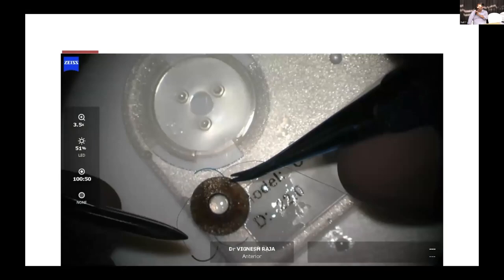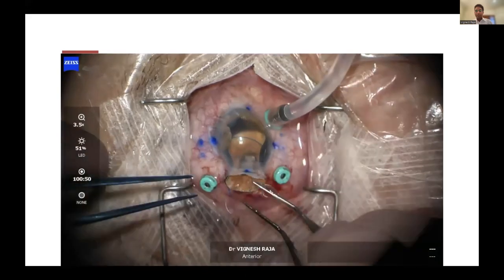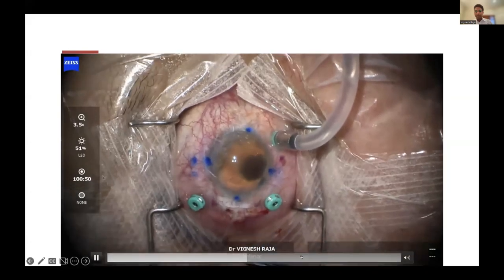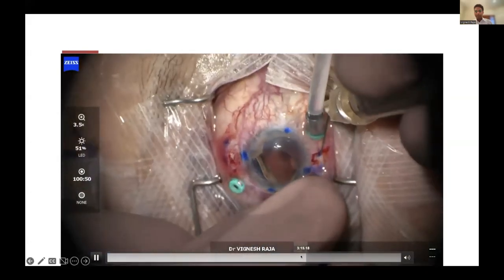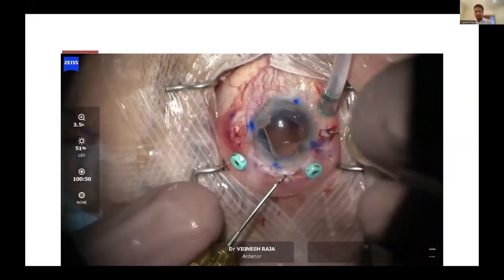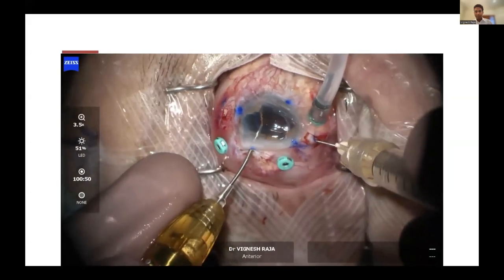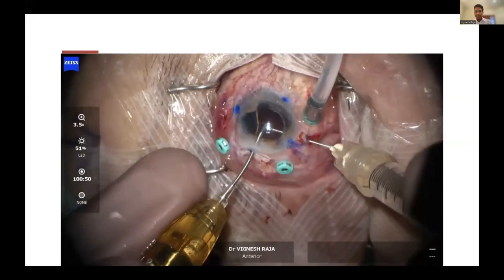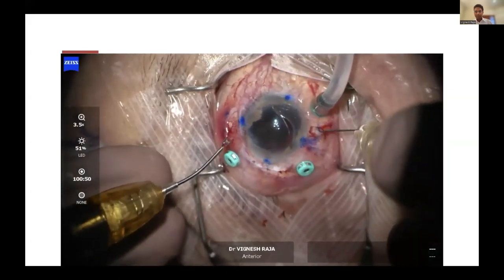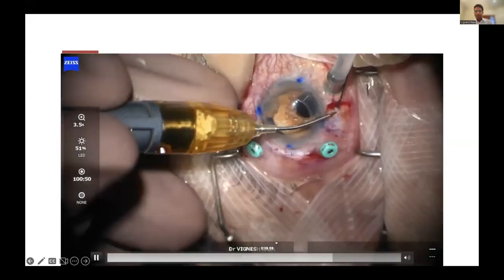Is it a PVDF haptic? PVDF, yeah. Then it won't break. So now I'm putting this in and securing the wound, and I'm then just doing a Yamane for this technique. Let me just show you. I've already secured the other side and I've already burnt off the haptic on the other side.